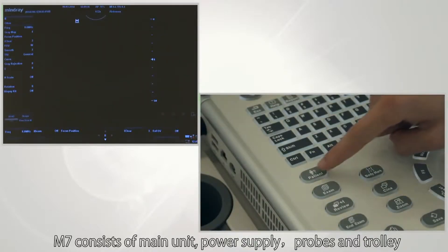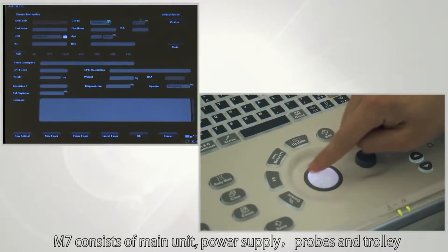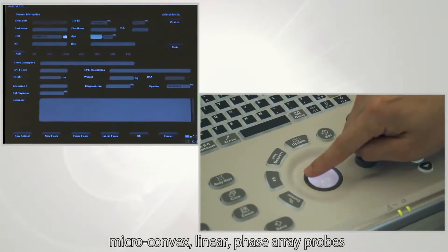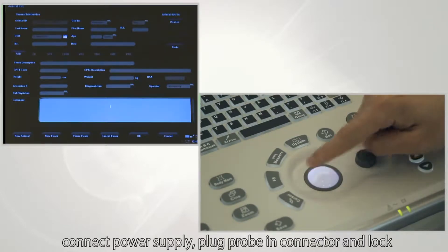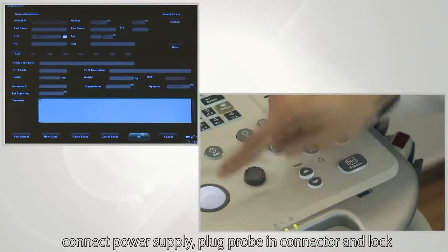Before the exam, press the patient button to enter an interface where you can enter patient information. Input animal type, sex, name, age, weight, and description. Press set to enter exam mode.